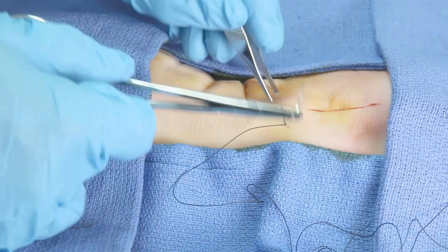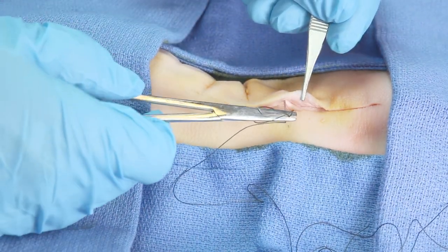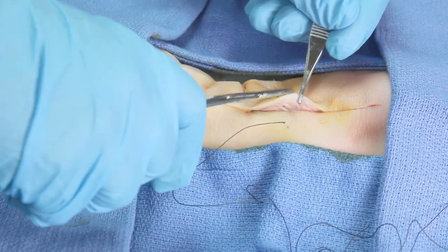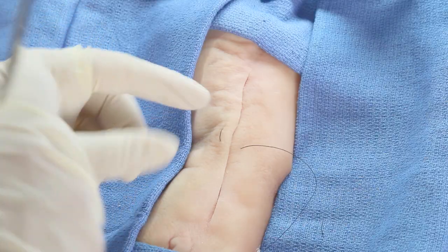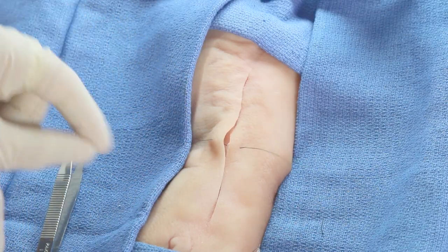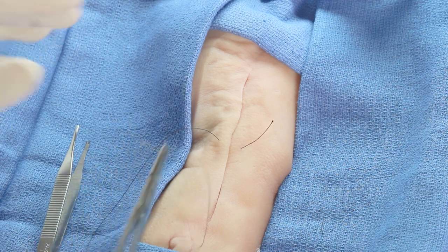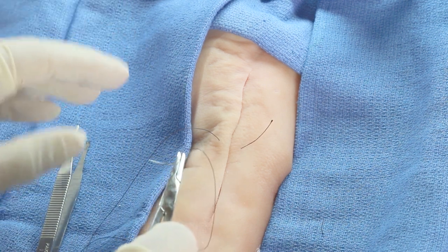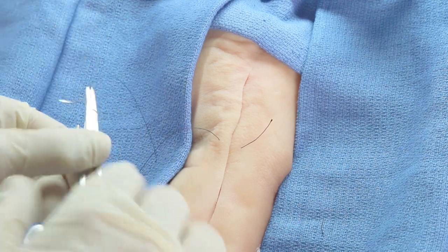Enter from inside to out on the opposite side, at about the same depth and width as the first, making the stitch as symmetrical as you possibly can. Once you're through the second side, pull the string all the way until you have one long end with a needle and one very short end without a needle. The easiest method to complete a suture is called the instrument tie, which is perfect for the survival medic as each stitch uses very little suture material.